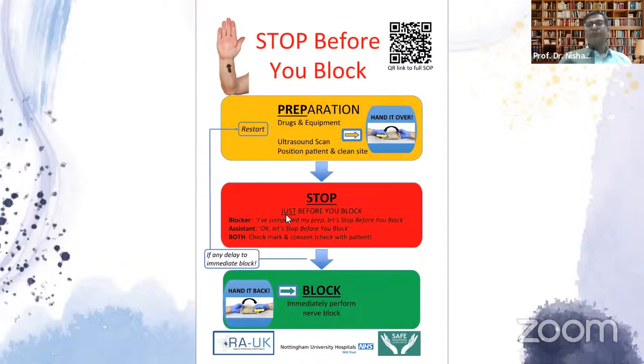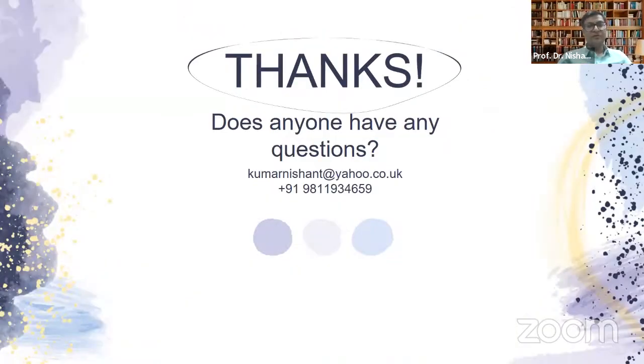The procedure that you're doing is the same. The drug is all ready. You've already done the scan and patient is prepped up. So just 3 steps: prepare, stop, confirm, and then you perform the block. This reduces complications. And with that, I'd like to end my talk.